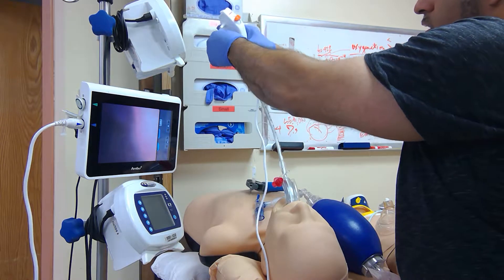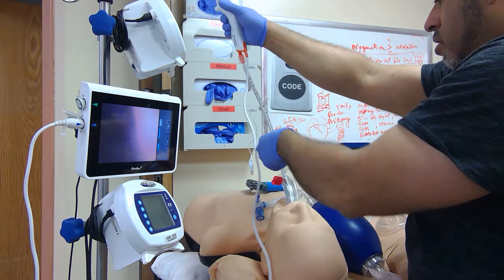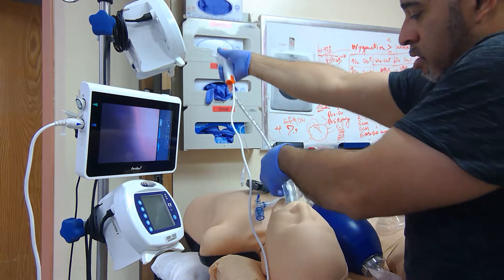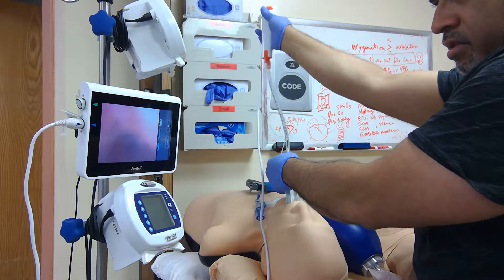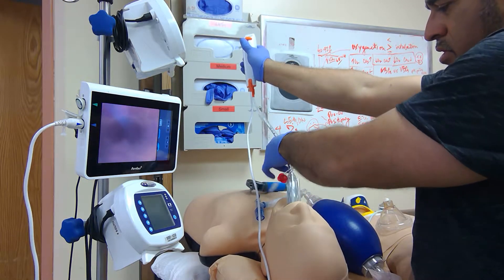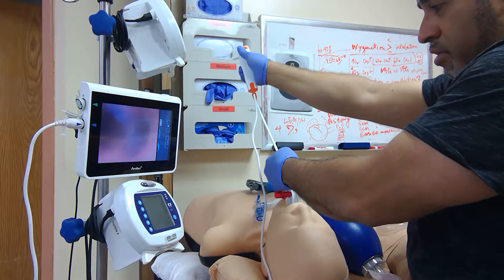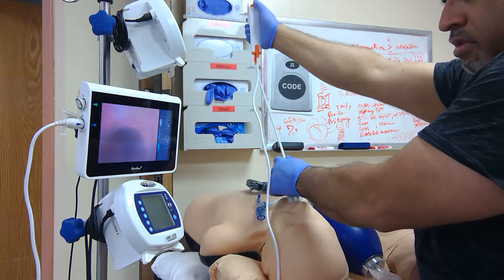I'm going to scope the tube a little bit. Once I see — as far as I can — I see tracheal rings. Advance your ET tube over. Basically your scope is acting like an expensive bougie. What I see now is definitely tracheal rings.